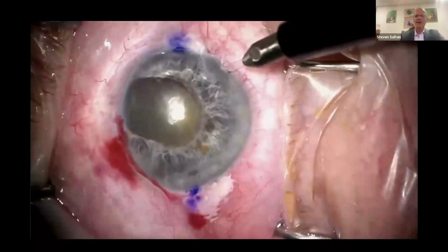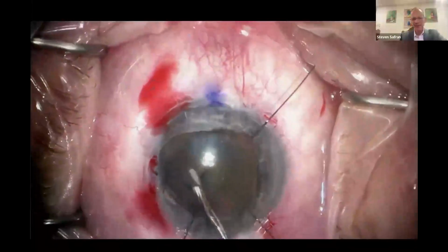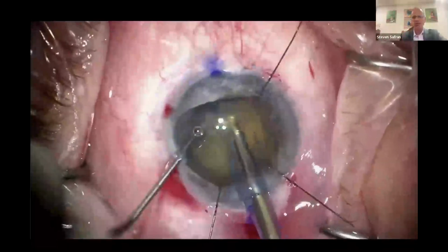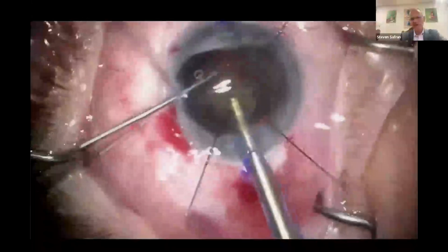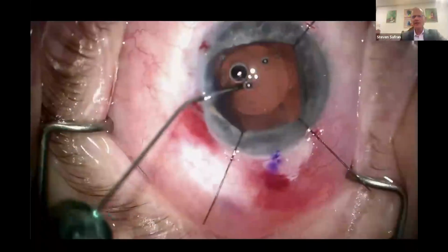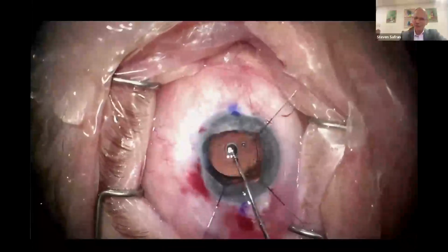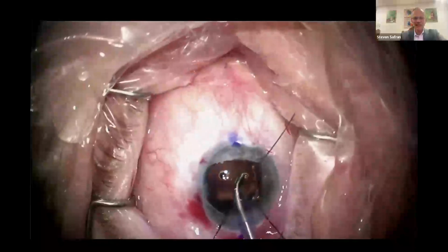I took him to the OR. And first I make some paracentesis and place some iris retractors. And I like to use VisionBlue in all these cases to stain the capsule. I get a feel for what my zonules are like. He's got a pretty dense cataract, but I chop it and phaco it. Irrigation aspiration goes well. And I feel that the bag is stable enough that I can just sort of put a CTR in to equilibrate the zonular forces, put my toric lens in and sweep for lens epithelial cells, clean that up.